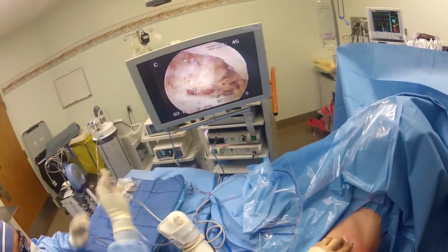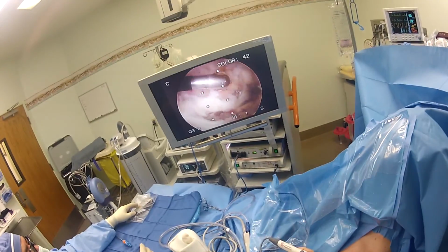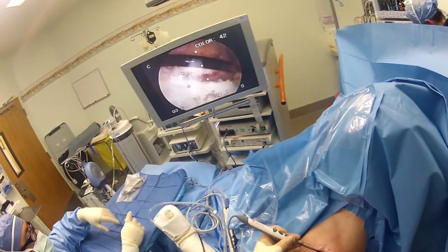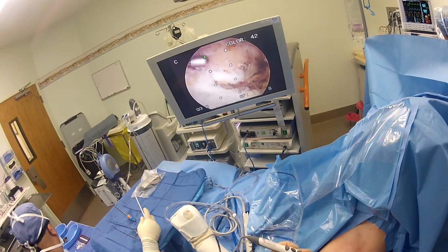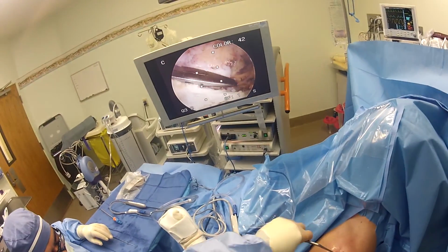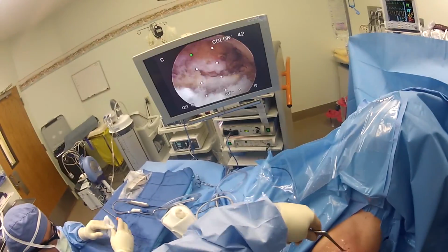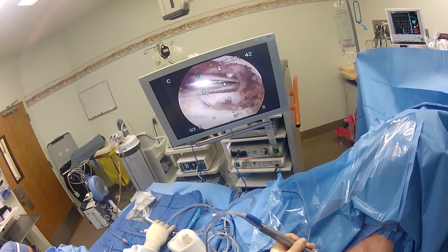Now I'm going to take a burr now. Now you can see here, I use the ablation on the bone to stop the bleeding. Oh, we got a pituitary. It's another thing I've found useful on my AC joint excisions: sometimes you'll get this osteophyte down here and it's really hard to burr away. So it's nice to have a pituitary in the room. And then you can just bite it out of there. And you know you're starting to get probably far enough once you start seeing the AC joint looking kind of flat.